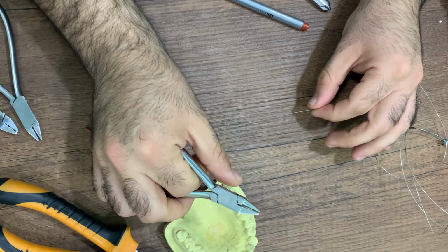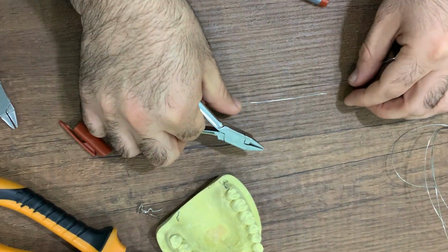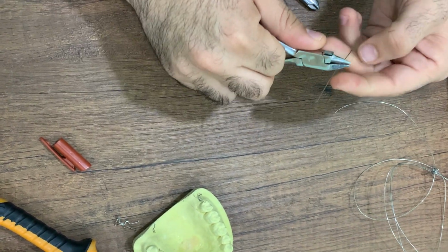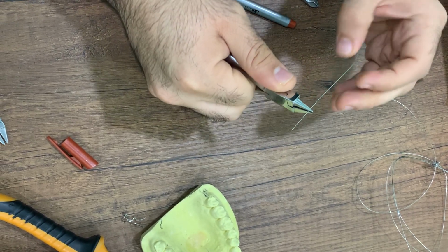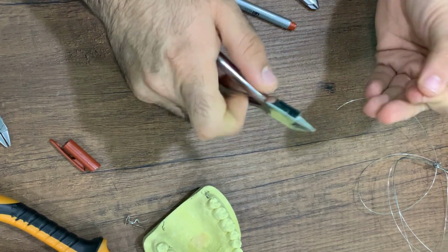Check the wire on a flat surface on the table before proceeding to know whether the wire is straight or not. Now the wire is straight.